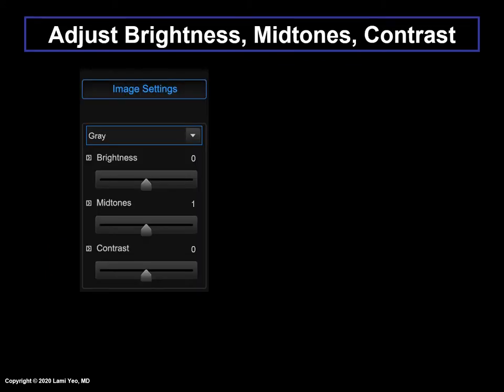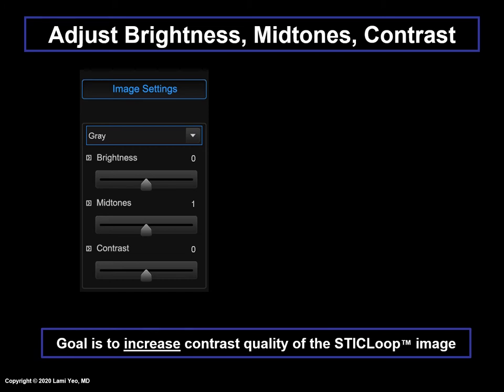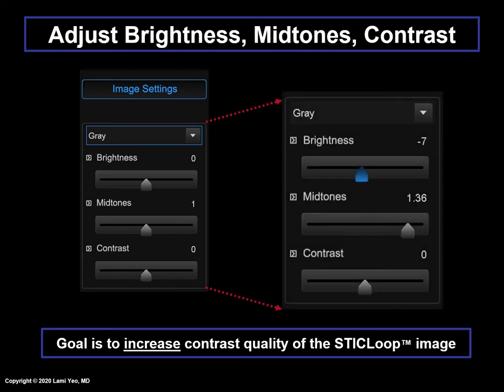The goal is to increase the contrast quality of the STICLoop image so that the marking process is easier. Here, the brightness has been decreased to negative 7, the mid-tones increased to 1.36, and the contrast remains at 0.